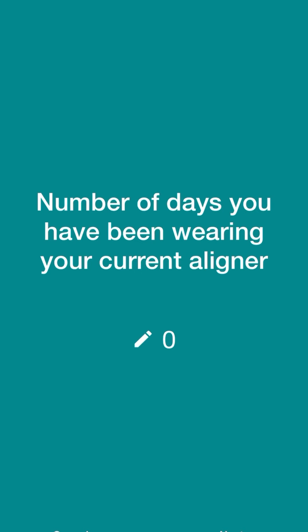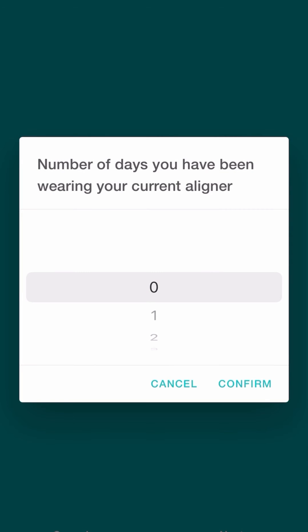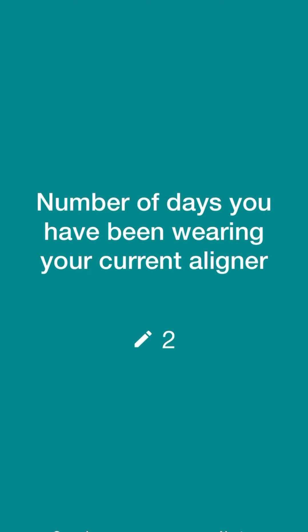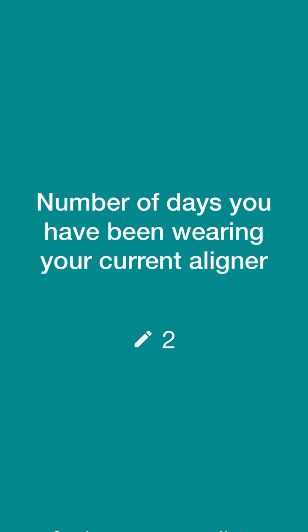The number of days you have been wearing your current aligner. Again, if this is your first day, you have been wearing your aligners for zero days. But let's say that you've already been wearing aligner number four for two days — you would select two.